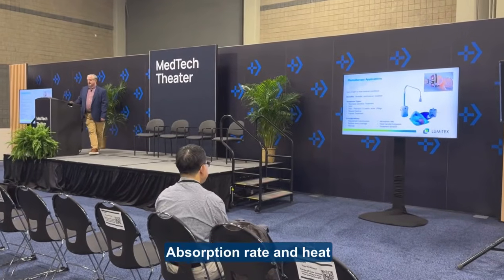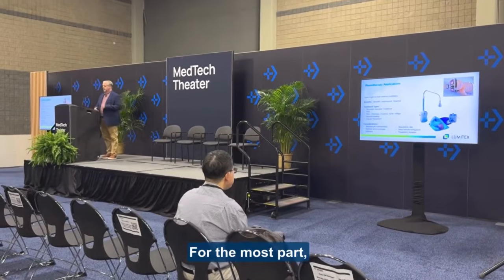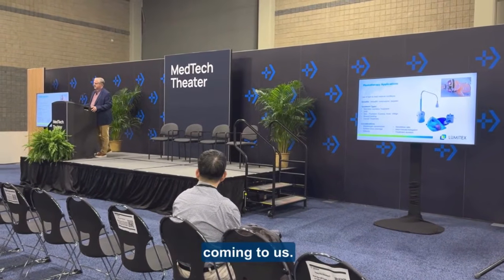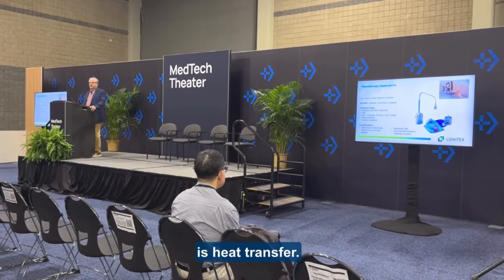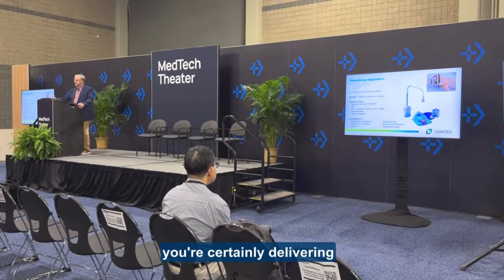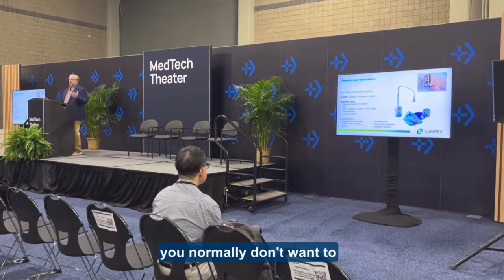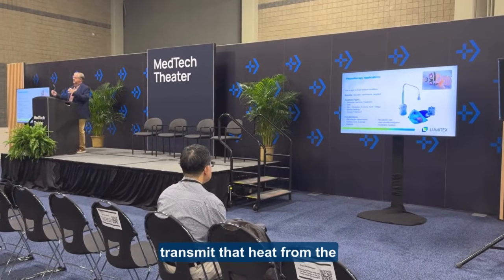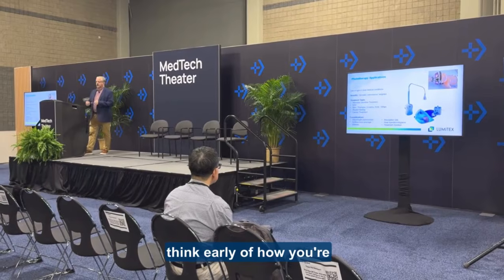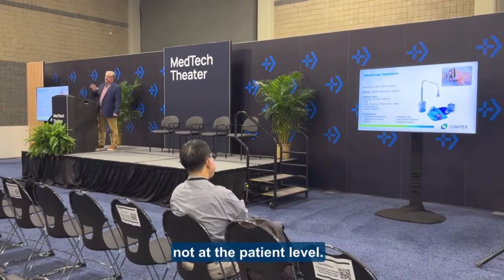Absorption rate and heat transfer kind of go hand in hand. I think for the most part, a lot of challenges we get with clients and customers coming to us, something they overlook is heat transfer. When you think about LEDs or any kind of light source, you're certainly delivering that light, but you're also producing a lot of heat. And as a rule of thumb, you normally don't want to transmit that heat from the source to the patient. So it's very advantageous to think early of how you're going to mitigate that heat and keep it at the source, not at the patient level.